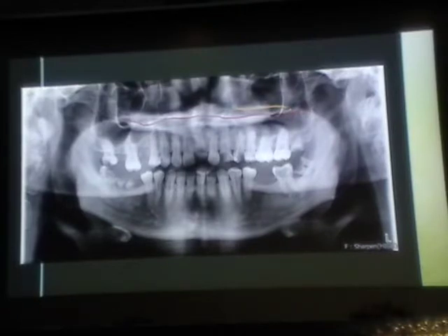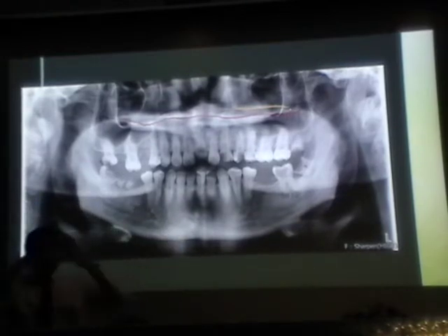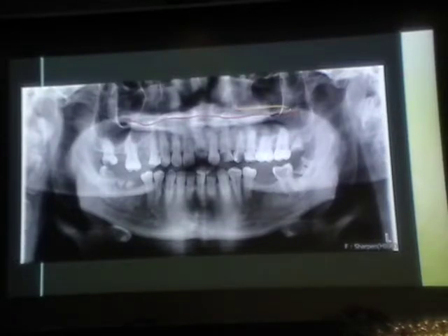Orange one is the, sorry, the yellow one. I thought it was orange, okay. Yellow one is the ghost image of the hard palate. The bottommost one is the regular hard palate. And here, what is this airspace called? And what is this airspace called?